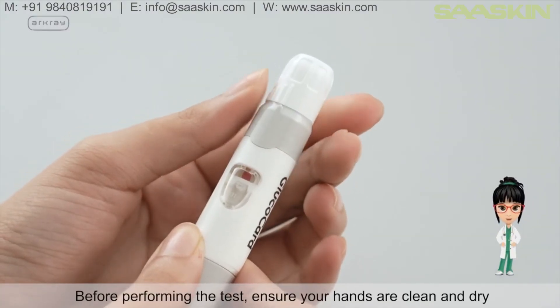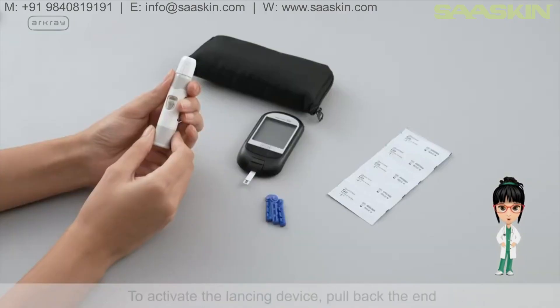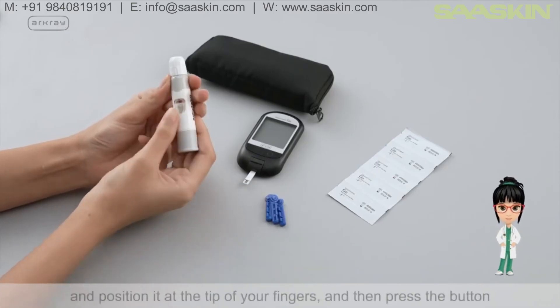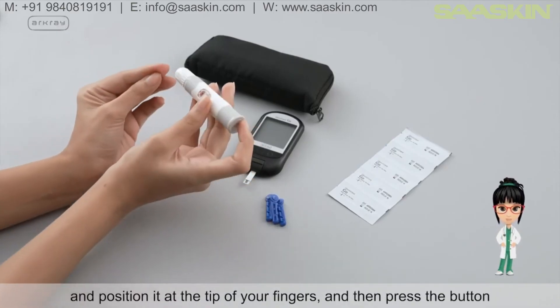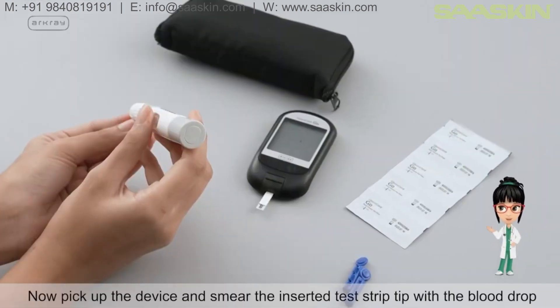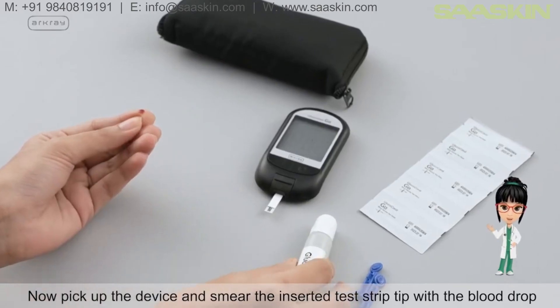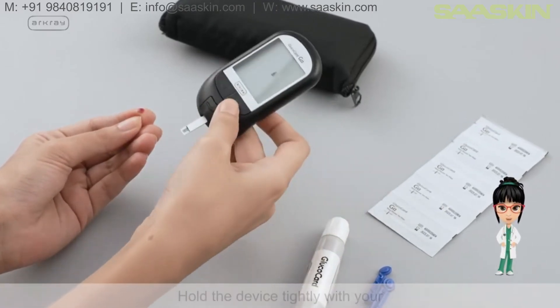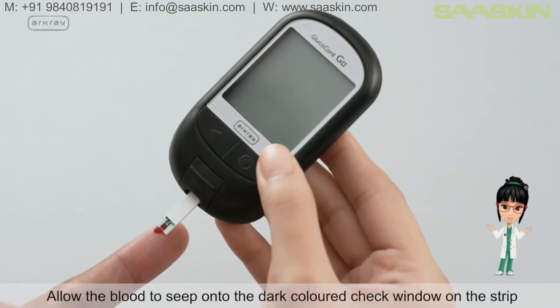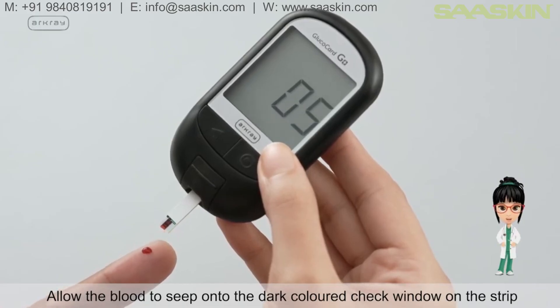Before performing the test, ensure your hands are clean and dry. To activate the lancing device, pull back the end, position it at the tip of your fingers, and press the button. Pick up the device and smear the inserted test strip tip with the blood drop. Hold the device tightly and allow the blood to seep onto the dark colored check window on the strip.